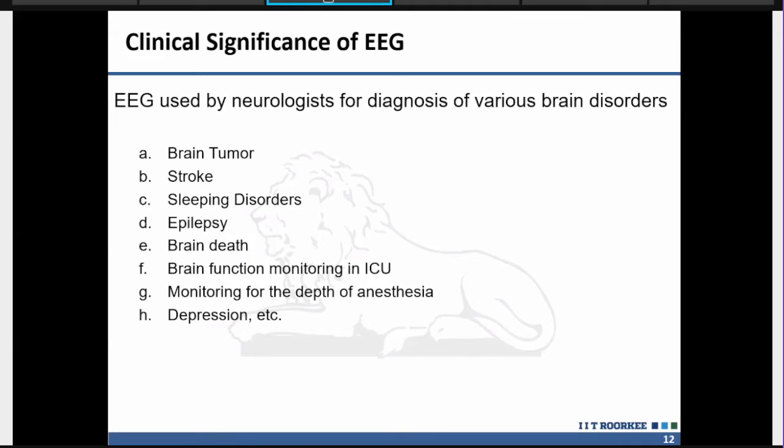All these brain-related diseases can be diagnosed with those signals, which were being done using fMRI and MEG devices. Using EEG you can do it in more detail because the resolution can be larger compared to MEG or fMRI, and EEG devices are much cheaper and very handy.